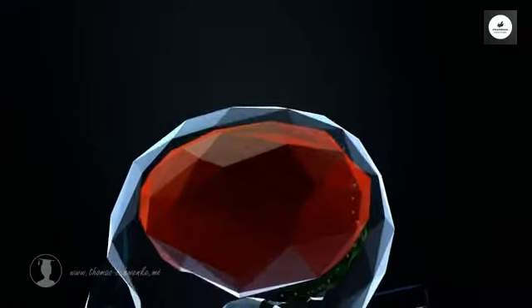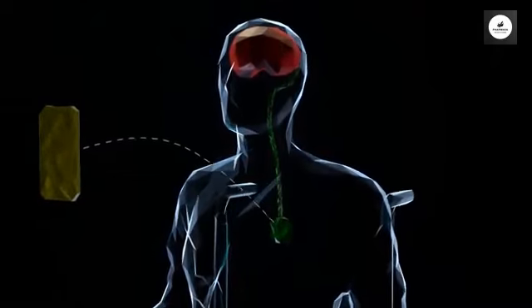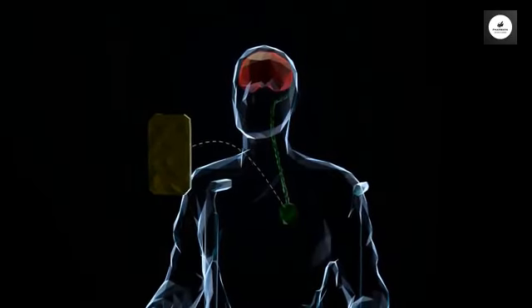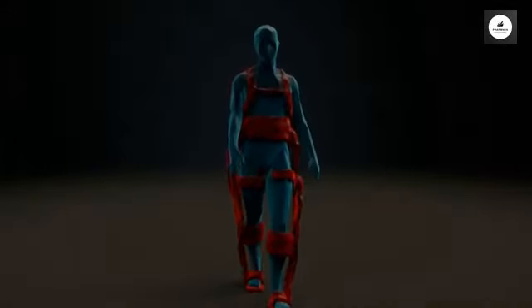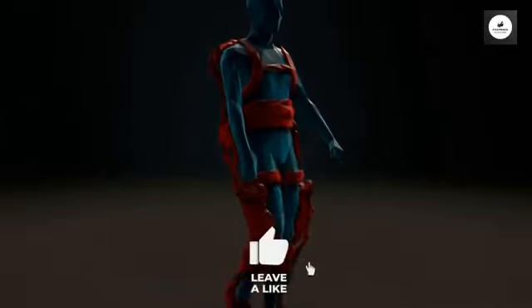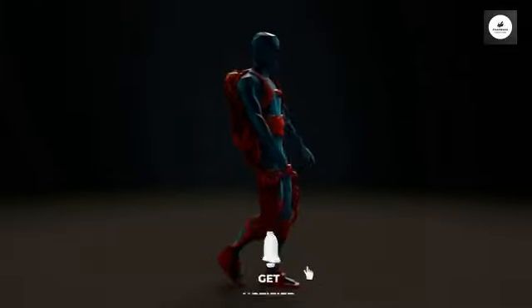The electrodes of the stentrode then transmit the voltages arriving in the blood vessel to a chip in the chest using a cable. This chip can then transmit the data wirelessly to external devices. Synchron is also experimenting with exoskeletons. The motors of the exoskeleton can be controlled by thought. In the future, people with paralyzed legs could walk again.